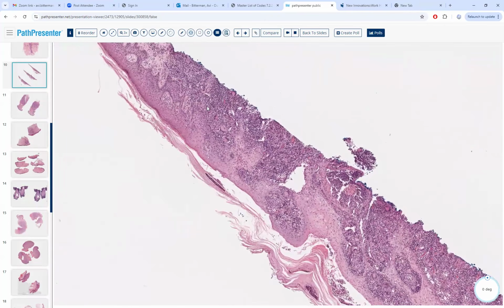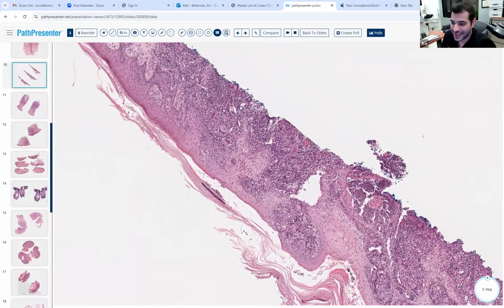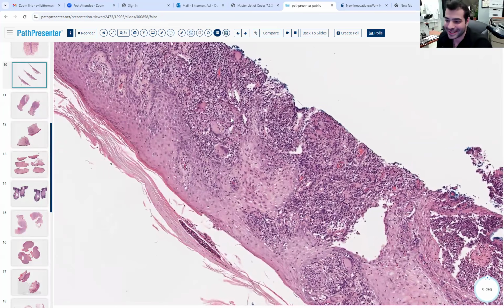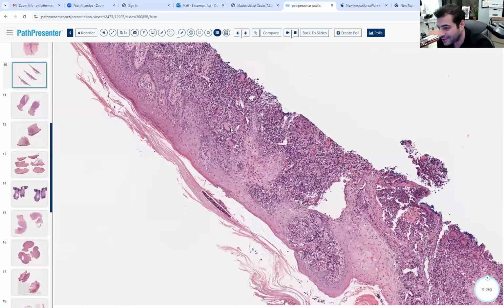Maybe superficially. Well, one thing: what cells do we have that take care of bugs? Bugs meaning not necessarily parasitic bugs, I don't mean insects per se. Macrophages. Macrophages or giant cells, right? If there's a giant cell, we might want to look at what's inside the giant cell.